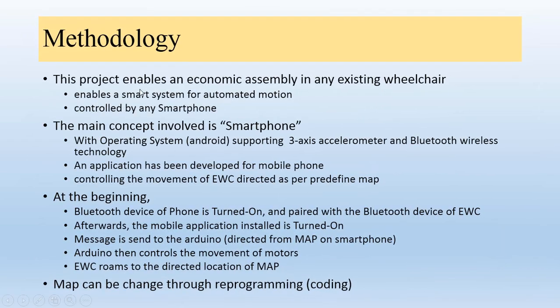Methodology. This project enables an economical assembly in any existing wheelchair. Means that we are adding an economical assembly in the available electric wheelchair, which enables a smart system for automated motion of that electric wheelchair, and this automated motion is controlled by any smartphone.